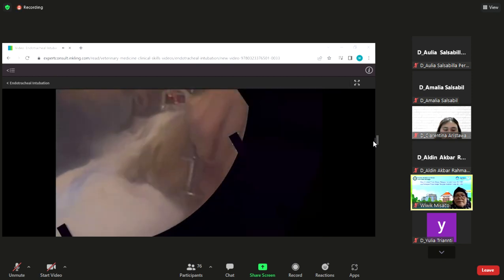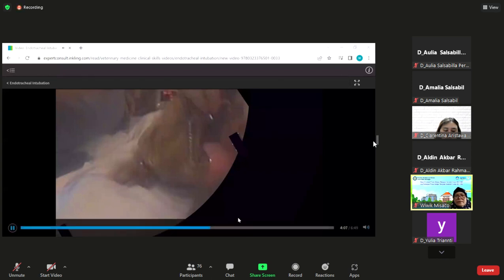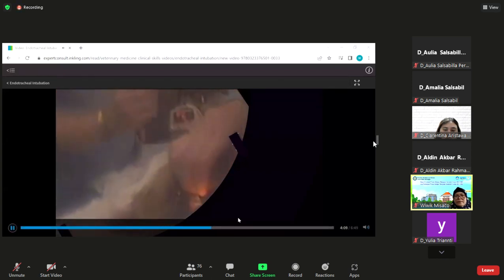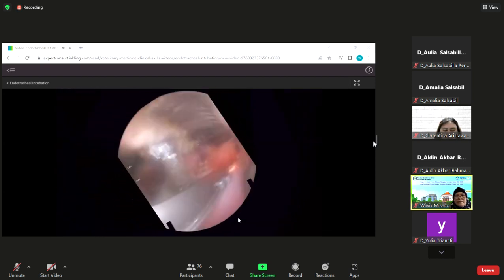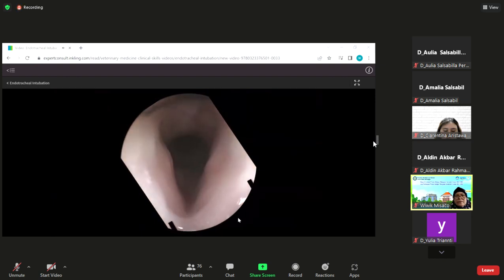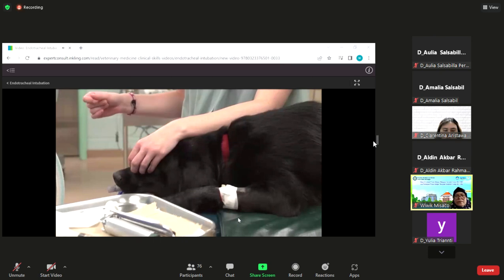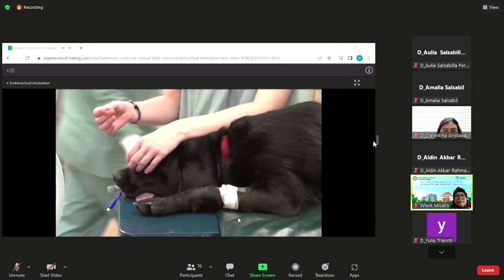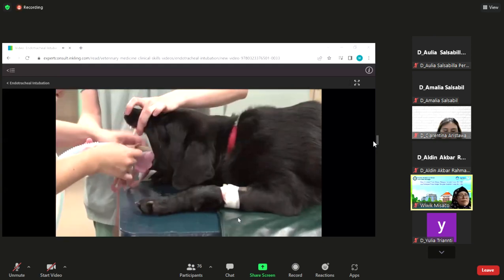Here's another look, fuzzier but even more on target, using an endoscope. This Yorkshire Terrier has the mouth held open and a laryngoscope is in place. We're now following the exact path that the endotracheal tube will follow. Into the mouth, then at the larynx, and when the glottis is open, we advance and we're in the trachea. With the tube in the trachea, connect it to the rest of the anesthetic circuit and set the initial oxygen flow and anesthetic concentration as needed.